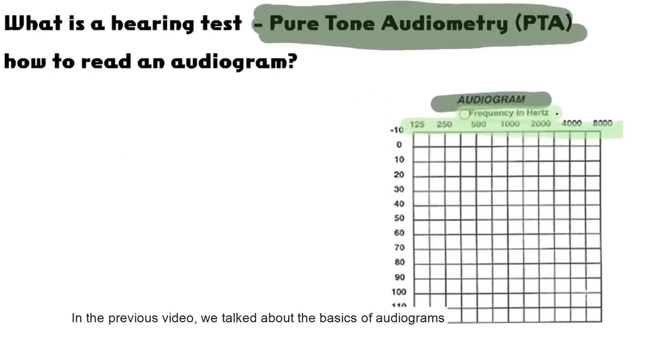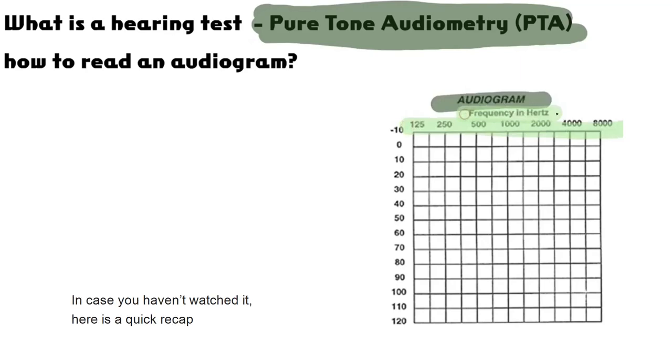In the previous video, we talked about the basics of audiograms, and today we will build on it. In case you haven't watched it, here's a quick recap.